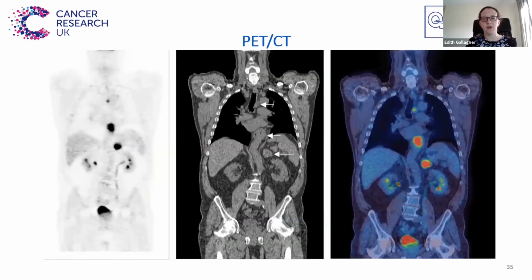Here is an example of a PET-CT scan showing esophageal cancer and two metastases, one a lymph node and the other the left adrenal gland. It is also possible to see some uptake in the kidneys and the bladder. This is because the radiopharmaceutical is being excreted via the urinary system. It is important for patients to drink plenty of fluids and go to the toilet often.